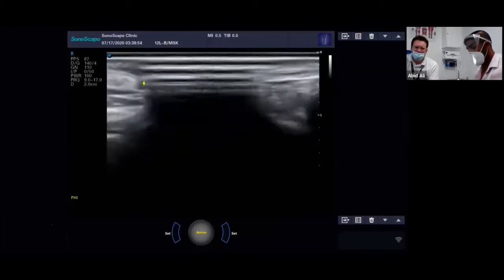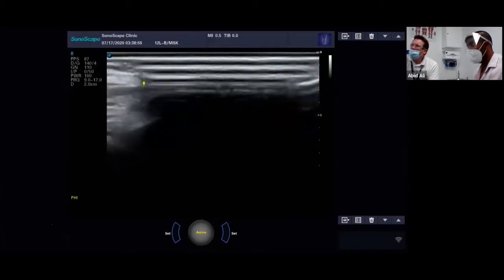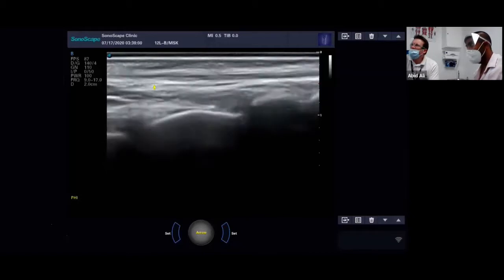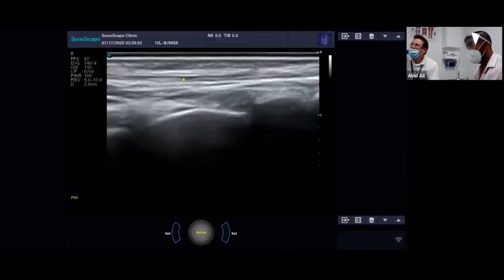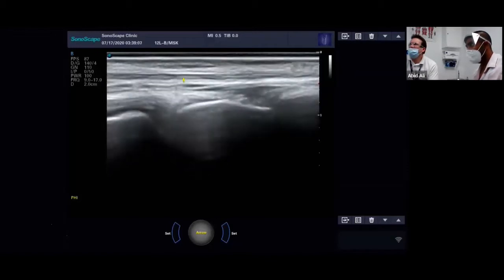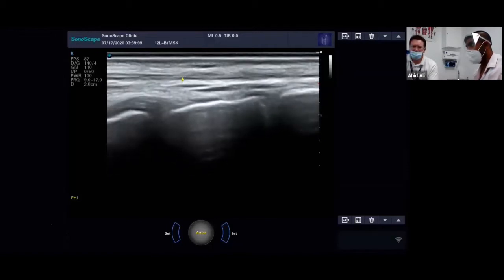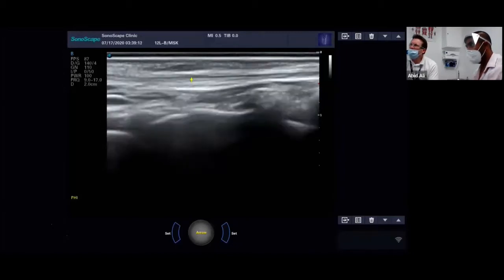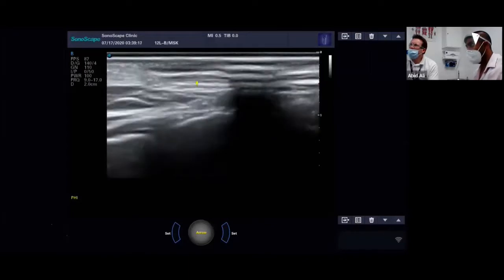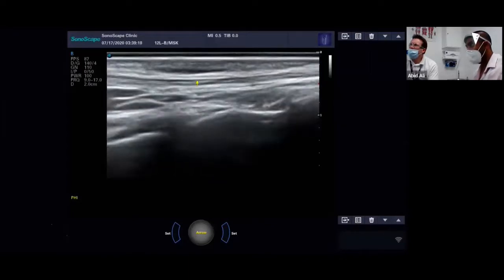And now you can see, if you get stuck, I lost contact there for a second. Just wiggle your toe again for me. So can you see how, if you let your toe relax, Adrian, it kind of melds in to the structures around it? It's not so easy to see. But if you ask Adrian to dorsiflex the toe again, you can see it's a bit clearer and you can see the movement. Although it's a little bit tricky here to keep the probe on it at the same time.